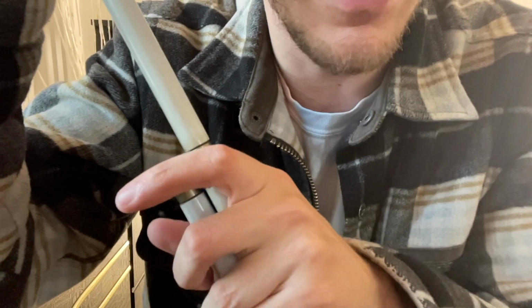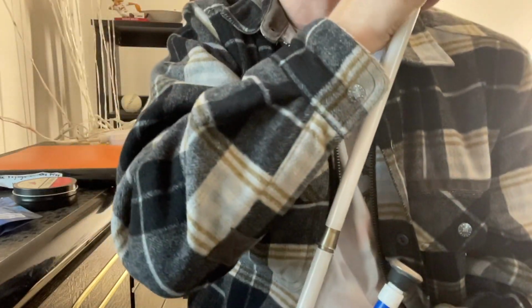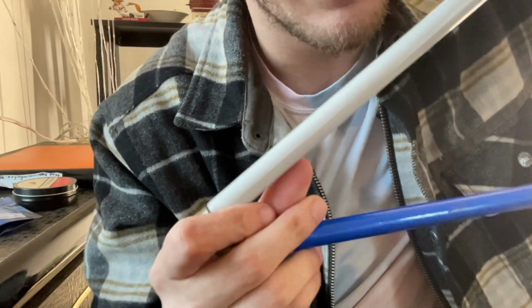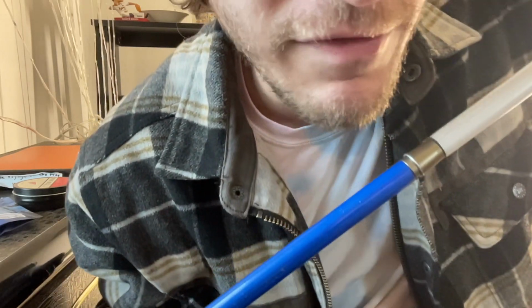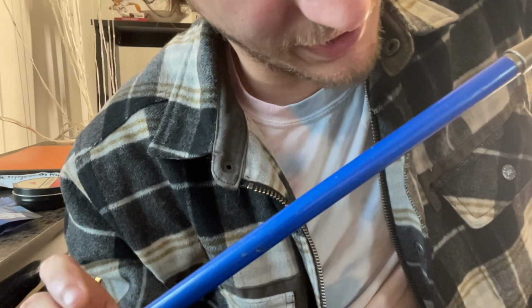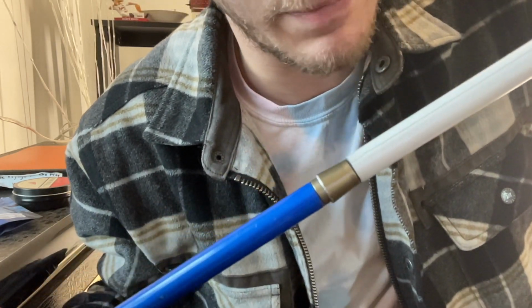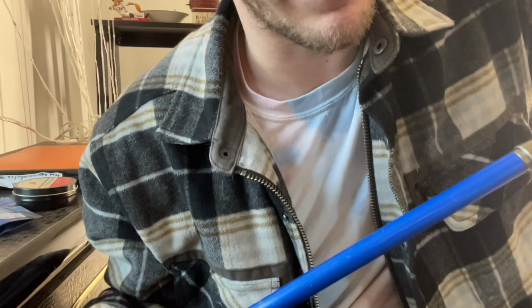So we have more of these foldy sections. We're gonna keep rolling on down, and if I don't take my ceiling out, which I'm gonna be very careful about here, there we go. So this bottom section, for those who may not be able to see it, is blue rather than red. I happen to be a fan of blue, and so I opted to make this bottom section of this particular cane blue, with the red being present on the reflective tape.